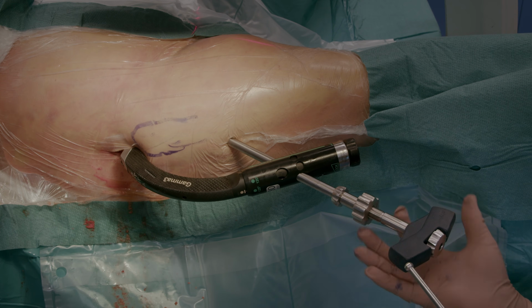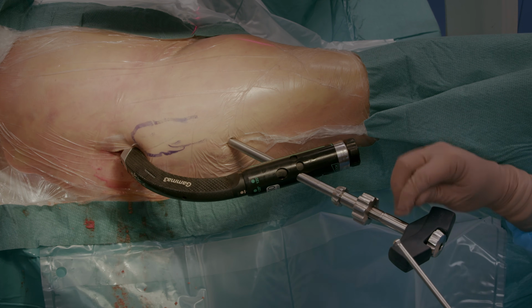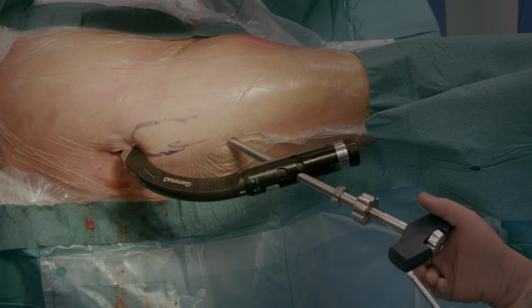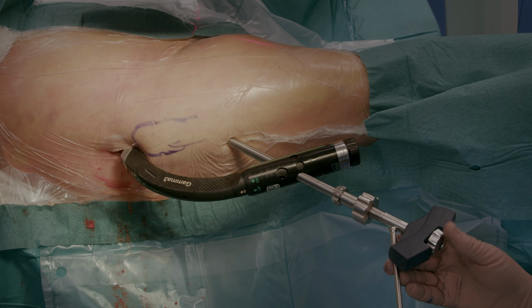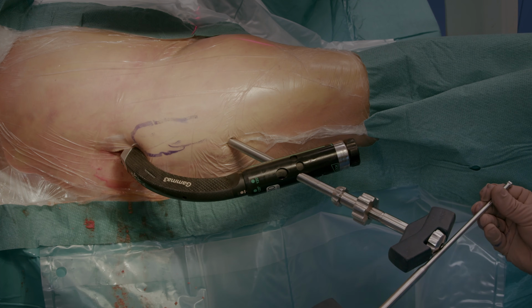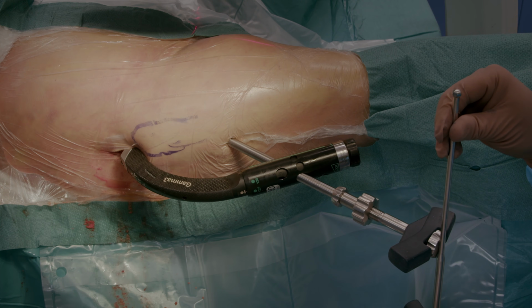Again, check the rotation of the insertion tool. These marks on the insertion tool also help to ensure the right alignment of the lag screw. Again, the handle is either parallel to or perpendicular to the target device.